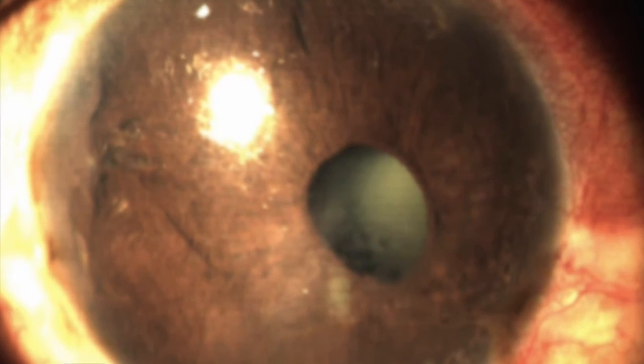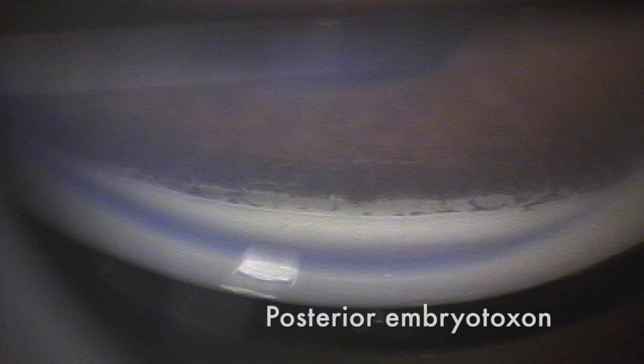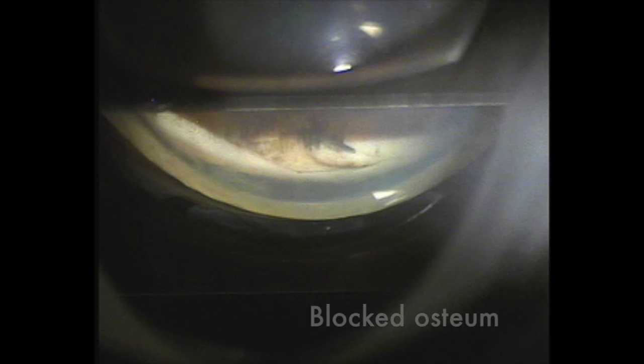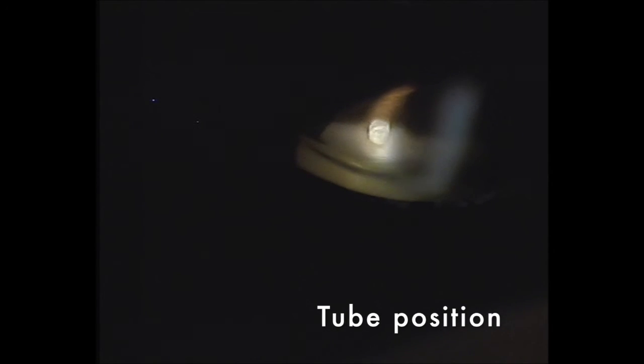Iridocorneal endothelial syndrome is characterized by peripheral anterior synechiae extending to or beyond Schwalbe's line. Mesodermal dysgenesis is characterized by posterior embryotoxon and multiple iris processes adherent to an anteriorly displaced Schwalbe's line. The status of the trabeculectomy stoma can be visualized by gonioscopy. Gonioscopy is valuable to examine tube position in glaucoma drainage implants.